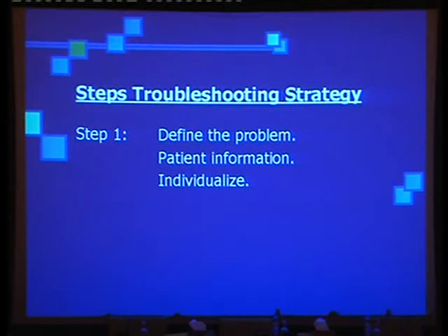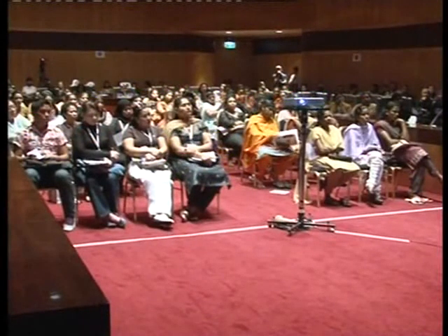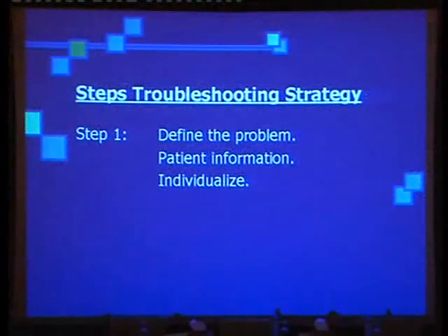Because first of all, you're supposed to think of the mode of the pacemaker. Is it DDD or is it VVI? If it is DDD, it has timings. It has four timings. It's sensing the atrium, sensing the ventricle, sensing atrium, pacing ventricle, pacing atrium, sensing ventricle. So you should be aware of that before you come to the conclusion that the pacemaker is not functioning.